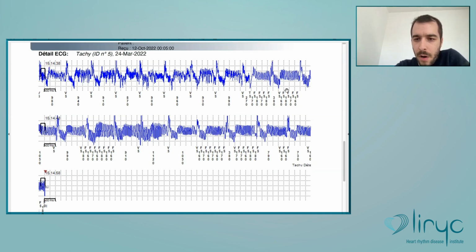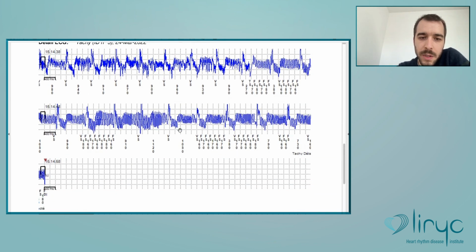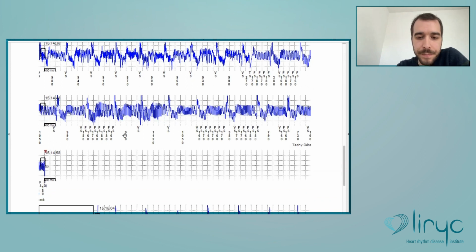And the FS markers. So as I told you earlier, there is another way to count tachy episodes with FastVT. So it's when you have 30 out of 40 cycles that are faster than 231 beats per minute. The counters of FastVT will be implemented. So this was a tracing in an asymptomatic patient that went in close contact with an electronic device that was not properly isolated. So this is electromagnetic interference.